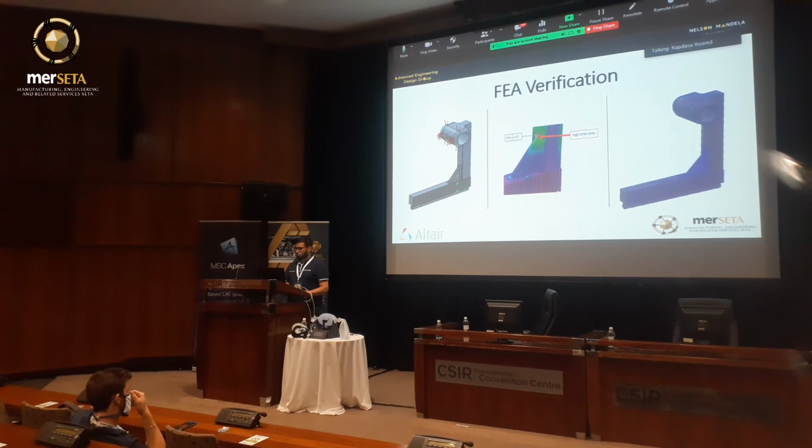Moving on, it is important to note that the safety factor occurs in compression zones, which basically means that fatigue failure is not a problem in that area. Also, the composite nature of Onyx is that the material has built-in crack arresters in the form of short carbon fibers, whilst the nylon matrix also has recognized excellent fatigue and impact resistant properties.